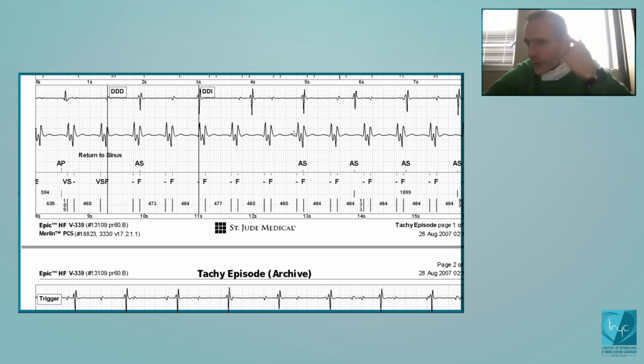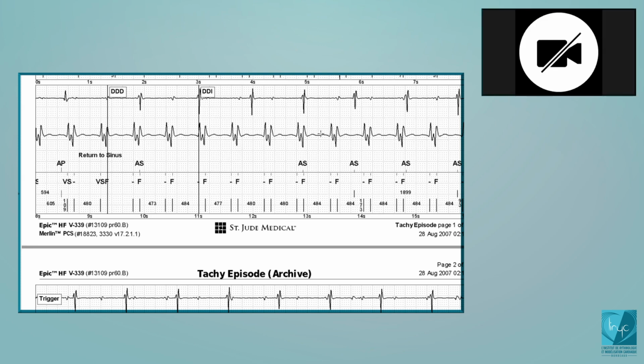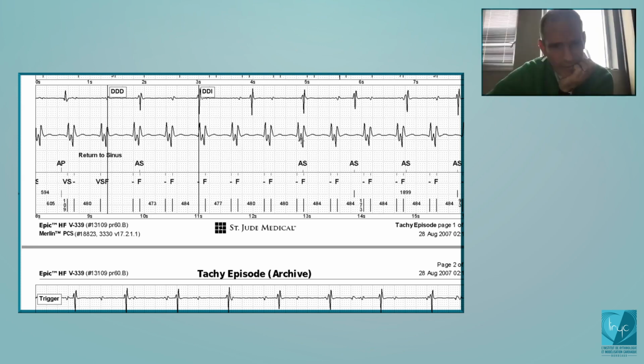If you require, for example, like in Medtronic, 75% of fast cycles in the VF zone, then the counter will not be filled. You understand that? Yes. And this is the only company where, with this kind of problem, at the end, you could receive an inappropriate shock.